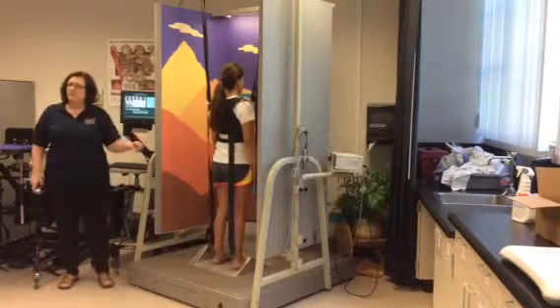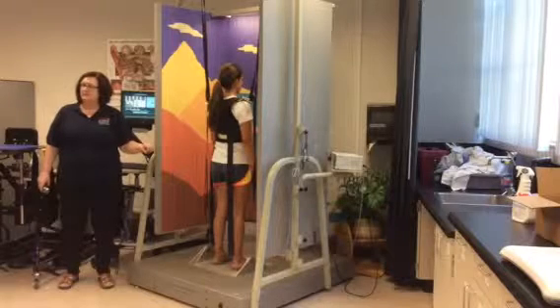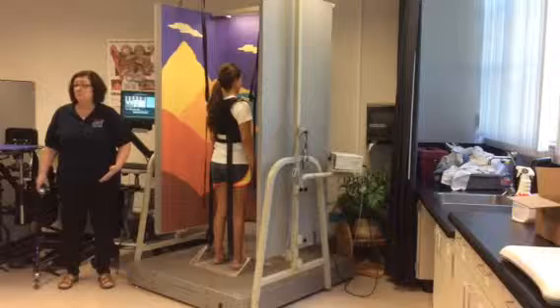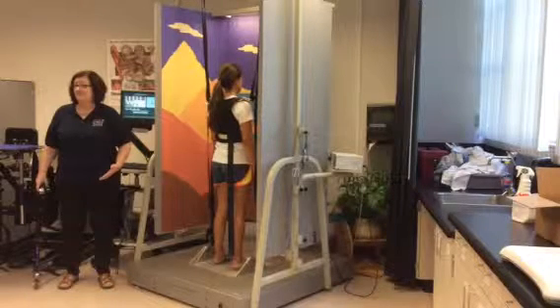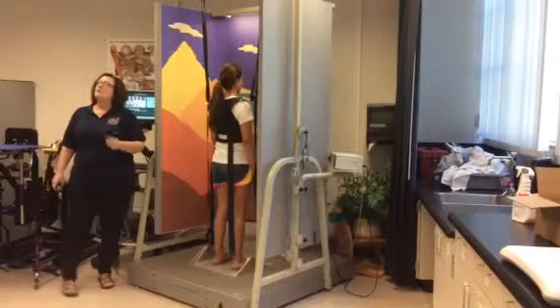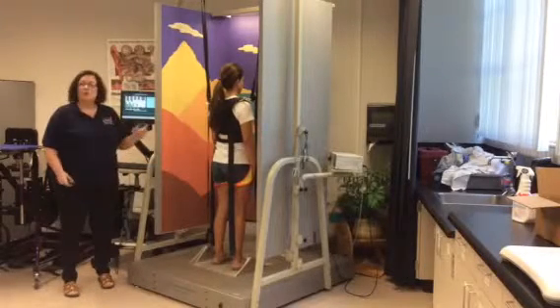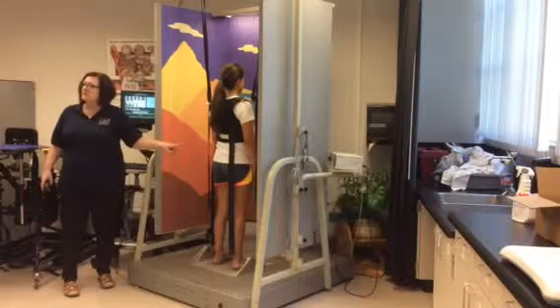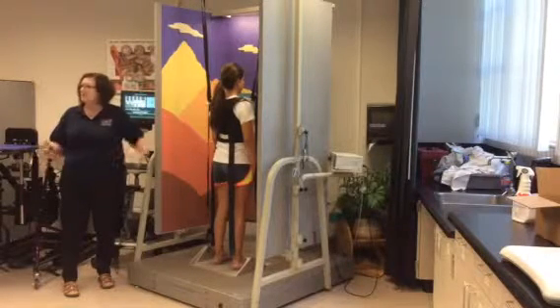Who should have trouble with this test? Only someone with a brain problem. Okay? So, if I have someone with multiple sclerosis, I want to know, is this still intact? If it's intact, what's my prognosis for their functional balance?